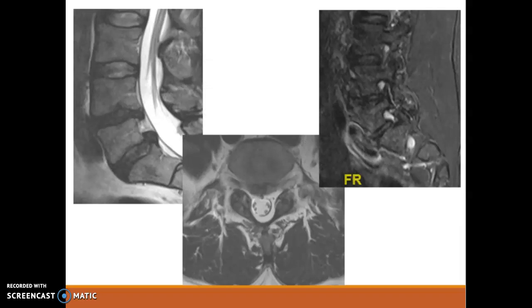Looking here at spondylolysis, which is a defect or stress fracture in the pars interarticularis of the vertebral arch itself. You can see here that potentially you've got that spondylolysis, and then that can lead to your spondylolisthesis later on.